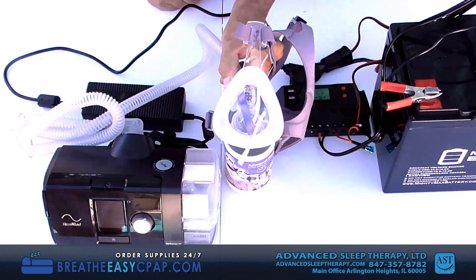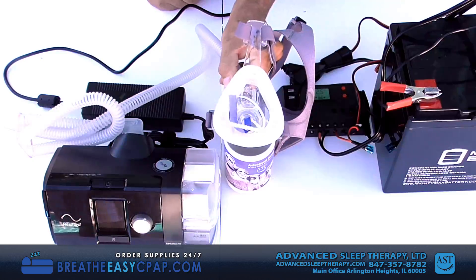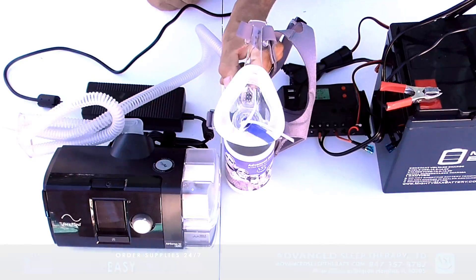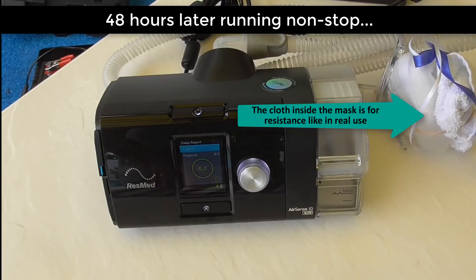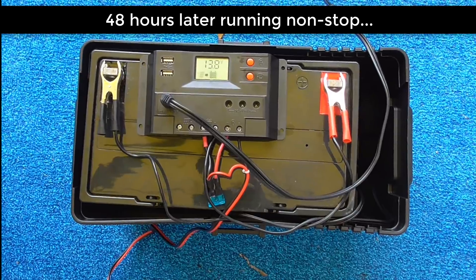This is a very practical setup. It does not require a gas generator and all the problems associated with its use. This machine has been running for over 48 hours — something you should never have to do in real life.